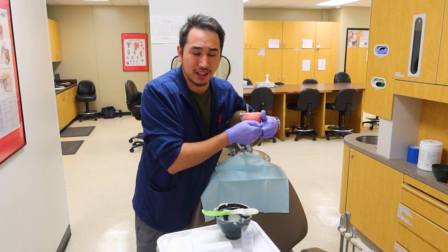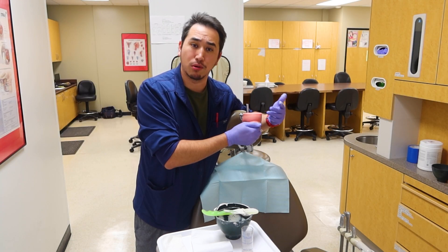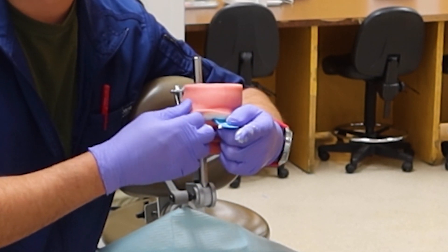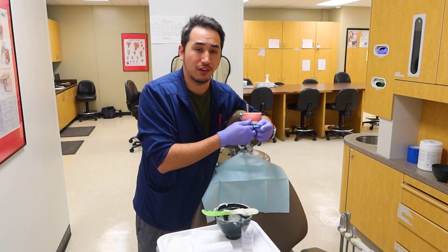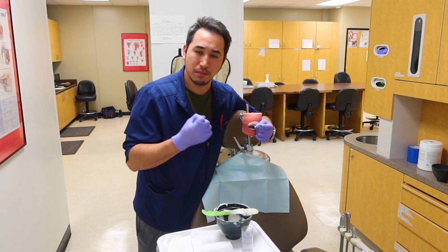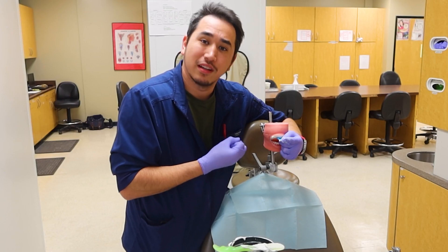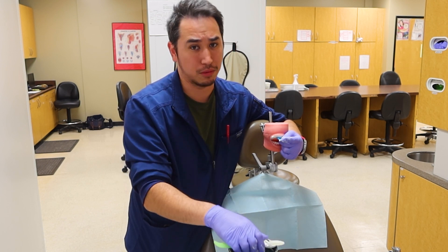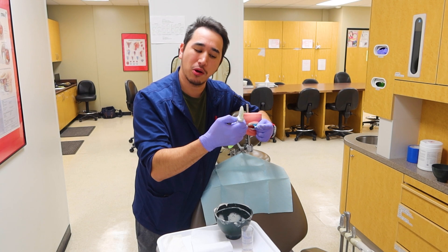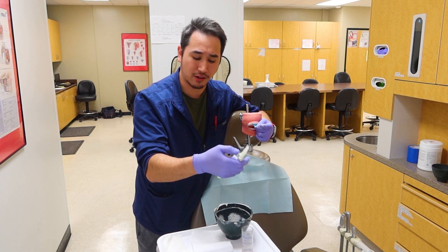Some assistants, especially if taking impressions for dentures or to capture vestibule areas, will do a little border molding — push on the cheeks or massage the material up into the vestibular area to get good mucosal folds so that when making a denture they have all the information needed to pour a proper cast. One of the most important things is: when do I take it out? Check the material on your glove or spatula — if it's starting to feel pretty firm, take your nail through your glove and push on the alginate slightly. If it bounces back, it's ready. If it impresses your nail, it's still capturing form and not ready yet. Mine's bouncing back, so now I can take it out.